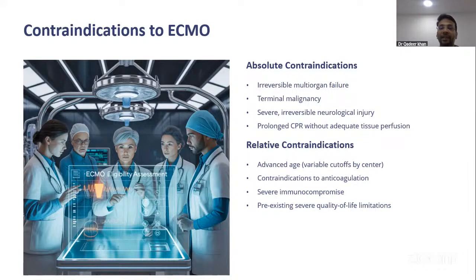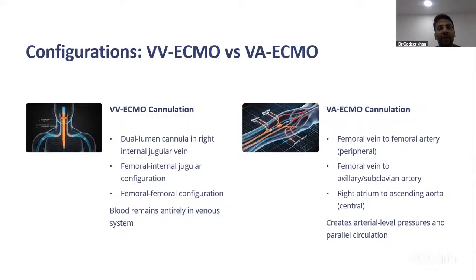Even patients with intracerebral bleed and all, they can use different modified circuits, not using heparin. In those situations, also we can use ECMO. So how is cannulation important?